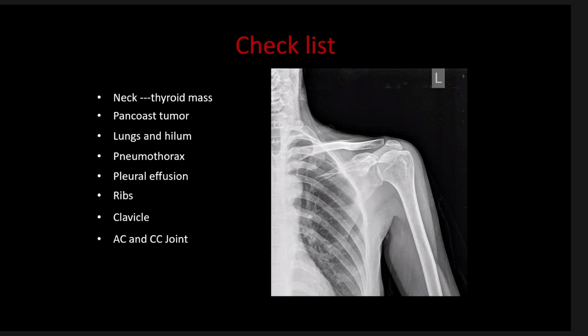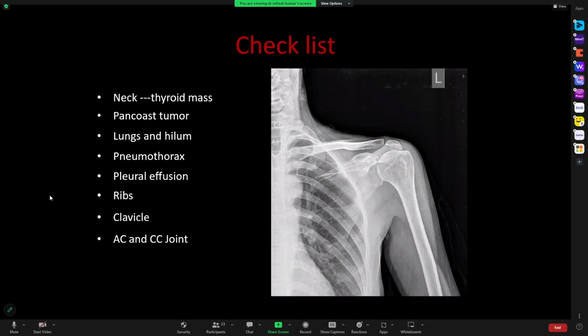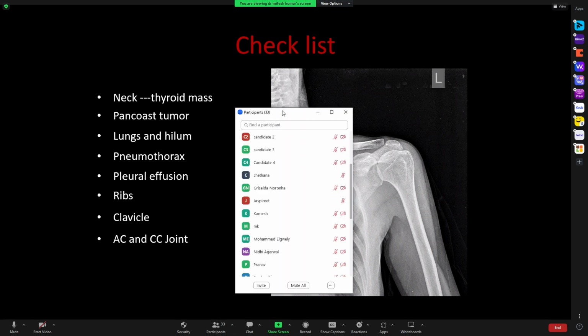Good evening, everyone. My name is Dr. Mitesh Kumar, and today we'll be starting from the reporting of shoulder joint part 2. So just a review of the checklist. Review of the checklist of shoulder joint.